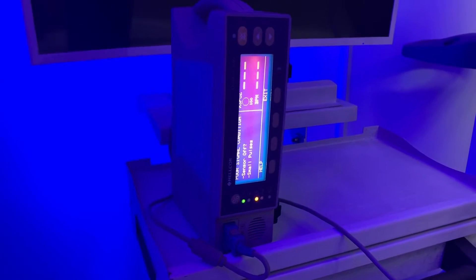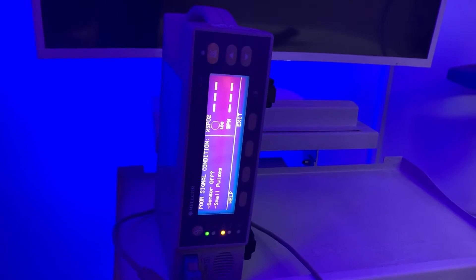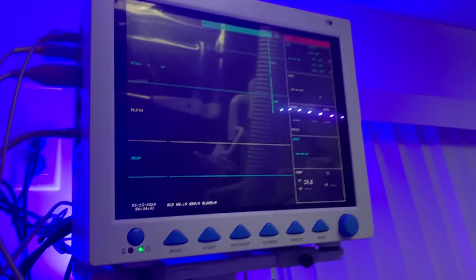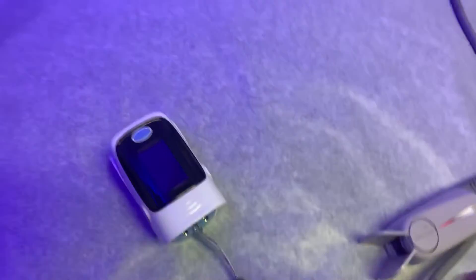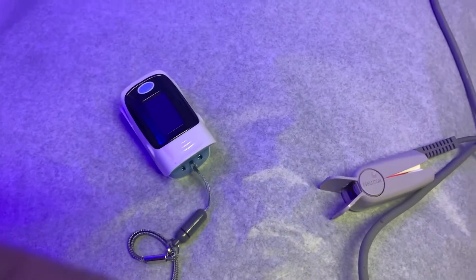I'm going to talk about the pulse oximeter today and the value of that for providing information for you when you're at home and what you need to do. The pulse oximeter — these are devices that come in different shapes and sizes. That's how they usually look in an emergency room or urgent care, sometimes smaller. In hospital and ICU settings they come as part of monitoring and are a bit bulkier, but thanks to technology, smaller and cheaper versions are available to purchase. I'll put a link for you to buy.